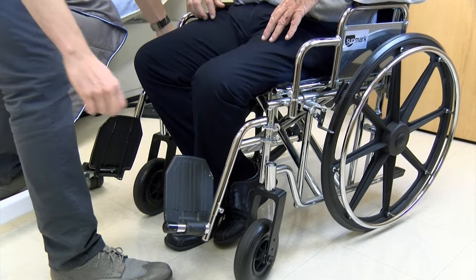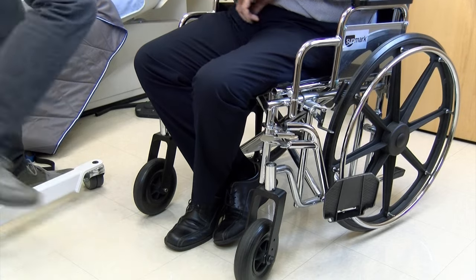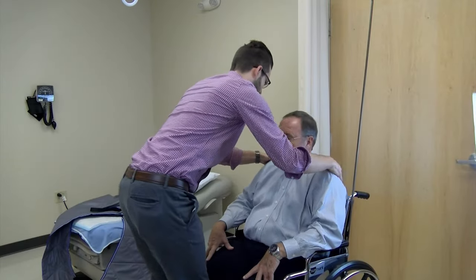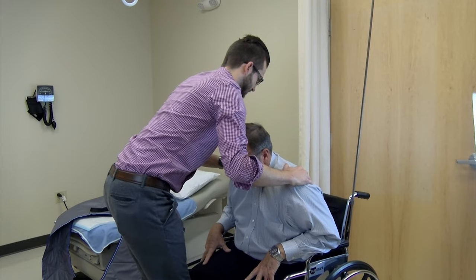Lock the brakes on the wheelchair and swing away or remove the leg rests. Ask the patient to lean forward, but be careful not to allow the patient to lean forward out of the chair. You may need someone to stand in front of the patient for this reason.